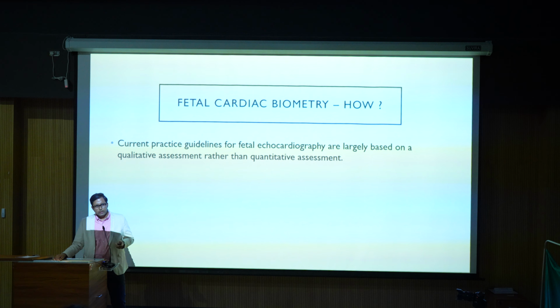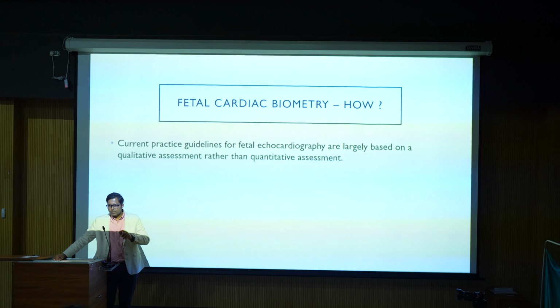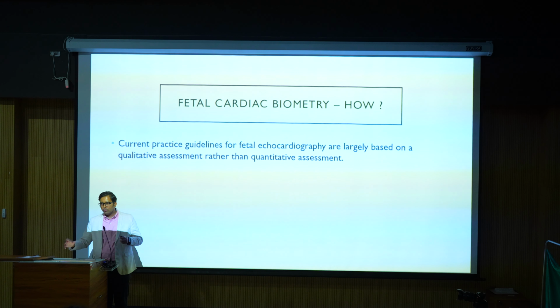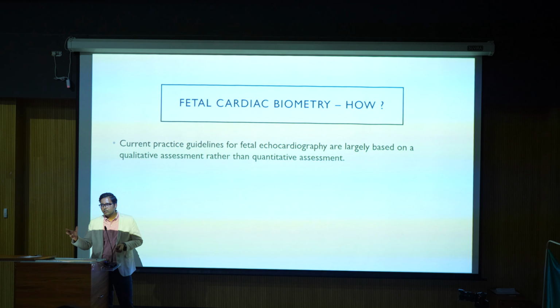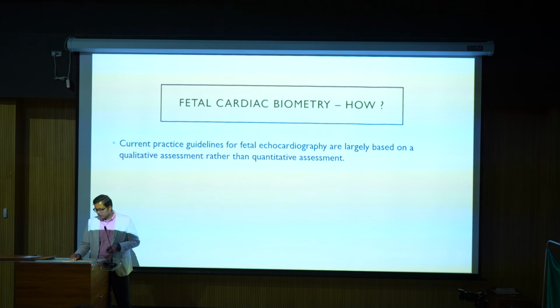Right, so just quickly I'll go through the fetal biometry. I'll just give a brief overview about how we actually take the measurements. Once you start taking those measurements, then obviously once you see the abnormal values, you'll come across the conditions where the Z scores change, whether it is too low or too high, and what are the pathologies that you can correlate with all those ratios or the scores that you can apply in your practice.